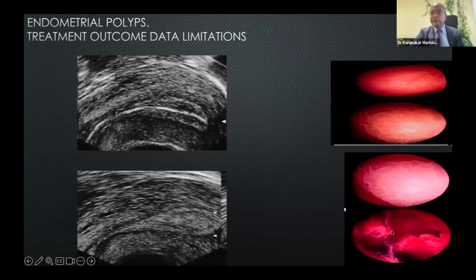So I do hysteroscopy after so-called polypectomy by DNC. I put the scope in and show them how miserable a DNC is as a procedure in infertility practice. Not only can you not remove the polyp, you just induce endometrial sclerosis. And the polyp will grow because you didn't remove it. So just because you don't learn hysteroscopy, you don't invest in a hysteroscope, we are still doing a mockery of care in many, many infertility clinics. Pathological.